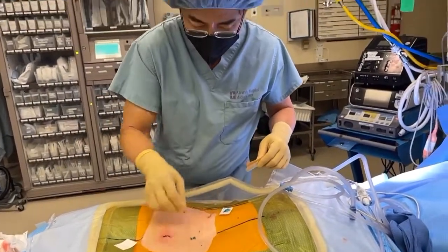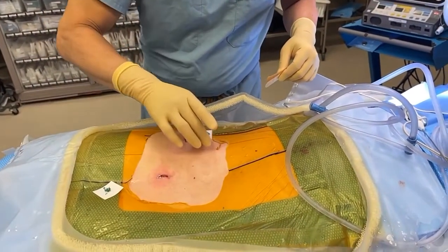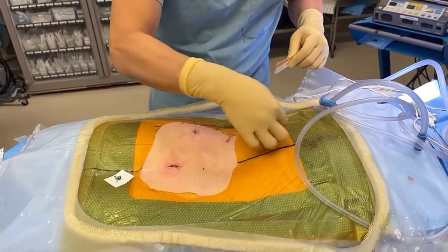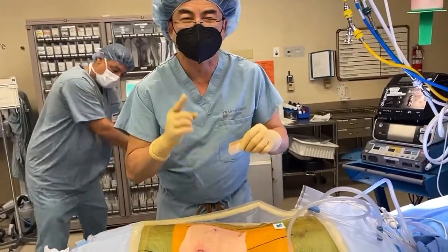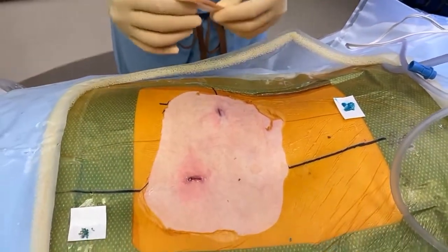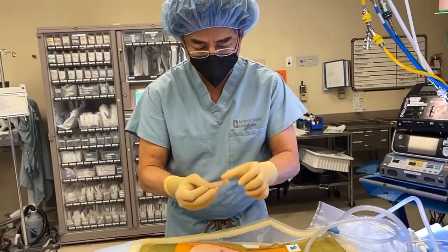Okay, surgery's all done. Here are some of the fragments from L4-5. That's where most of this was right there. And here's some of the L5-S1. Most of it washed out in the irrigation. And then you've got this one with a buck tooth and another tooth. He's got a beautiful vampire smile. From which we will place these cute little band-aids.